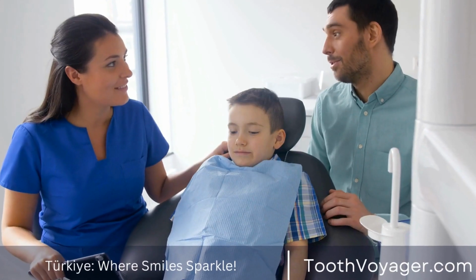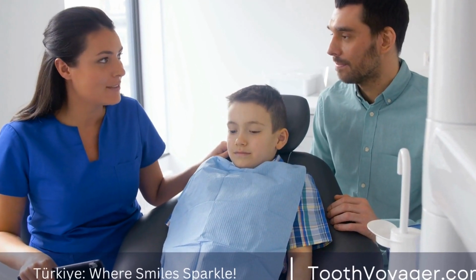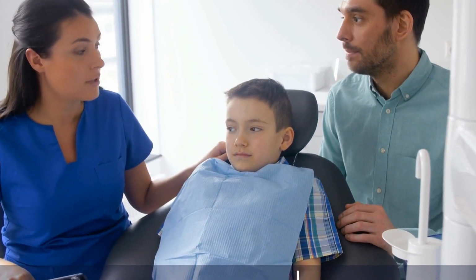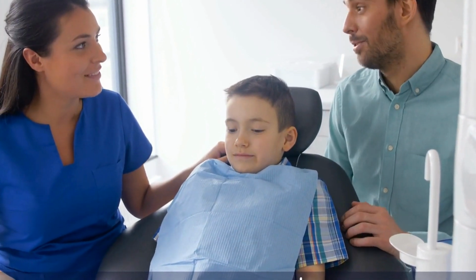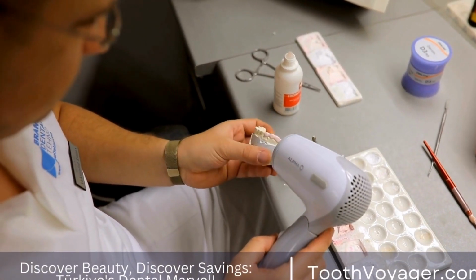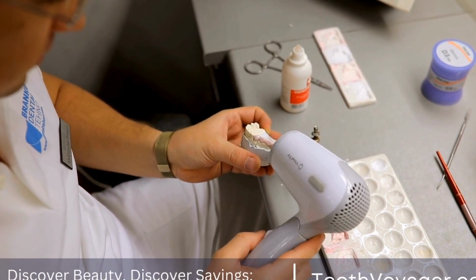It acts as a connection between the implant and the crown, which is the visible component of the tooth replacement. The traditional dental implant is a versatile alternative and can be used for replacing missing individual teeth, or even whole dental arches. They are a natural and sturdy solution that could endure for years with proper upkeep and treatment.